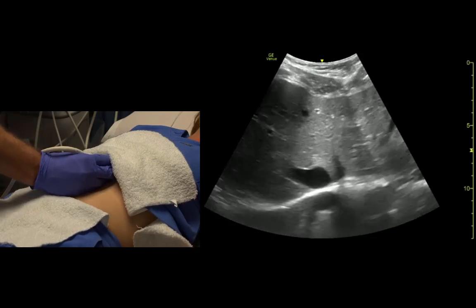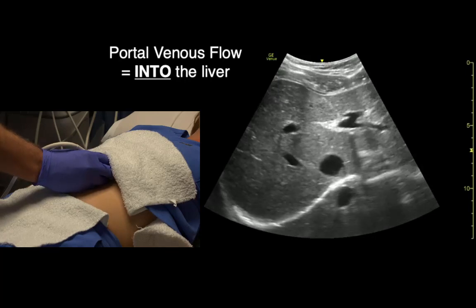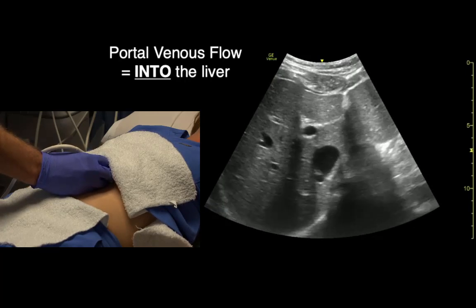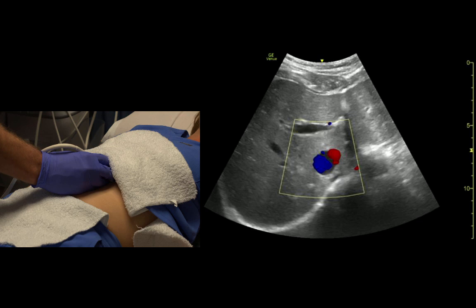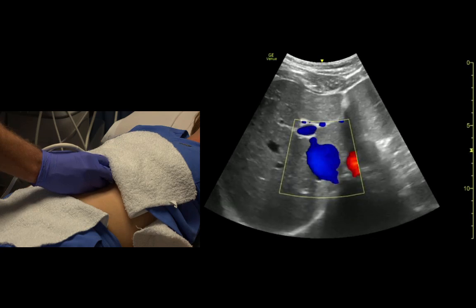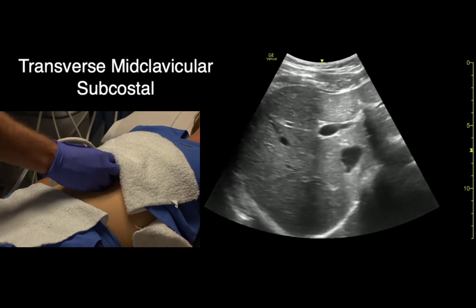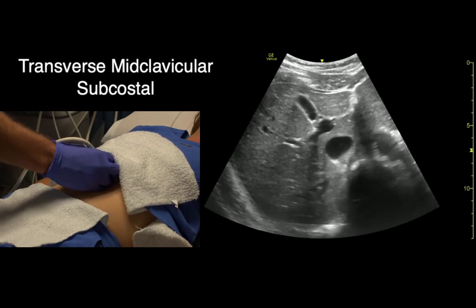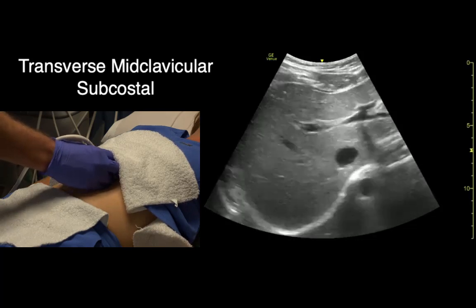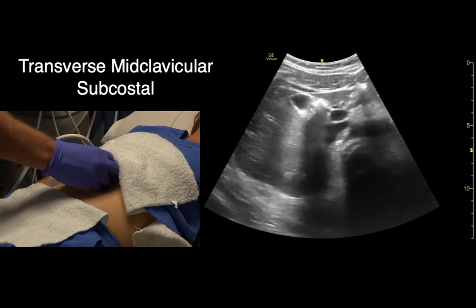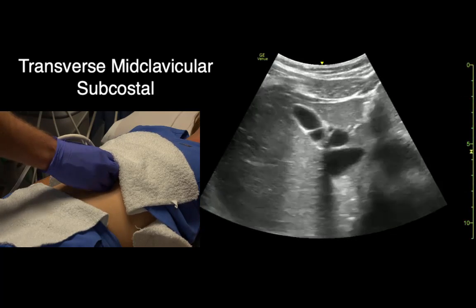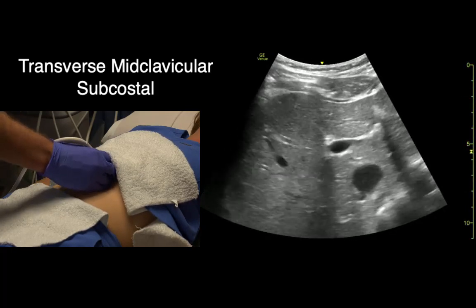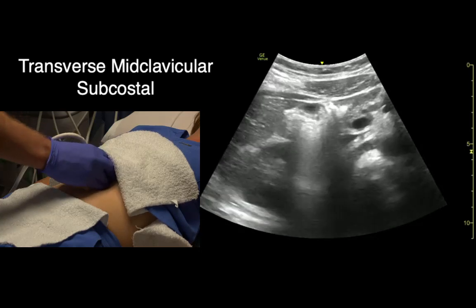Hepatic venous blood drains out of the liver. If we fan down towards her feet, we can see the gallbladder come into view. Right there — her gallbladder has a little fold. The gallbladder is also a landmark to divide the right and left lobes of the liver.